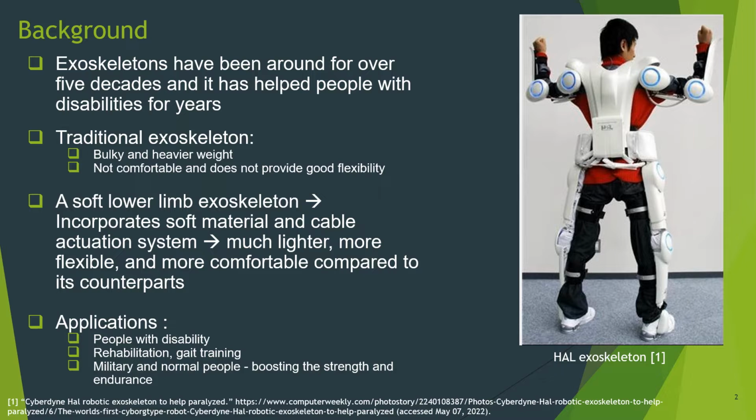Applications of these soft exoskeletons: they can be used by people with disabilities for rehabilitation and gait training, by the military, and by normal people just to boost strength and endurance and carry heavier loads.